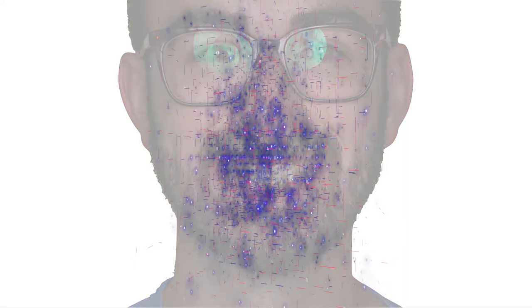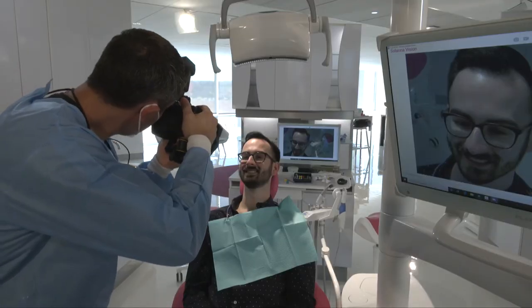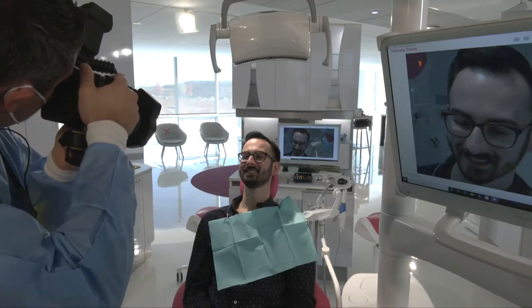So the first step to basically creating a digital twin of your patient is going to start with some quality photographs. So we're going to have to digitize our patient. And the way that I do that initially is just with some simple photographs. And one way that I like to do this is with DSLRs.